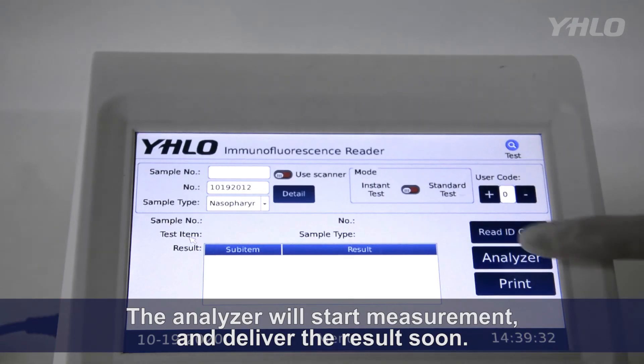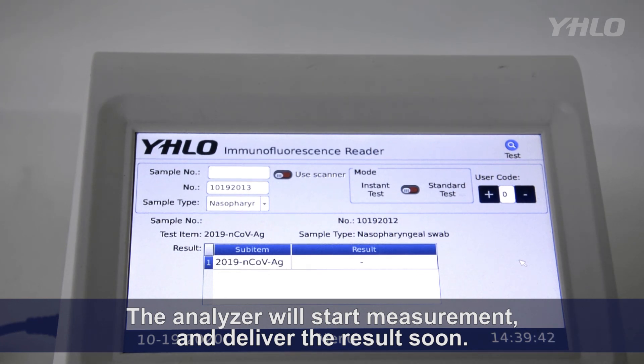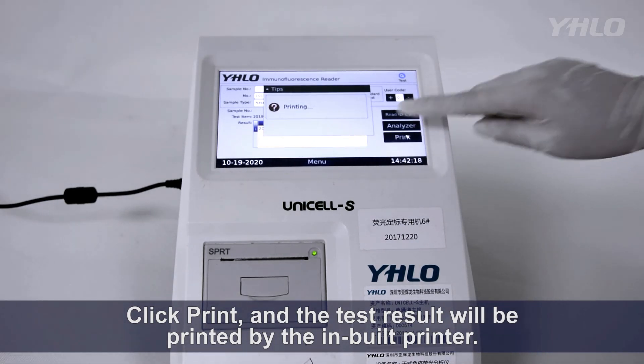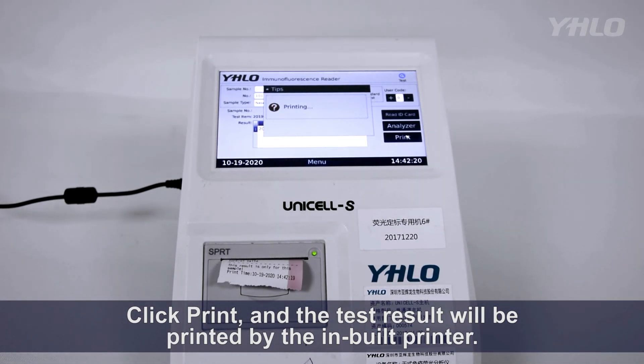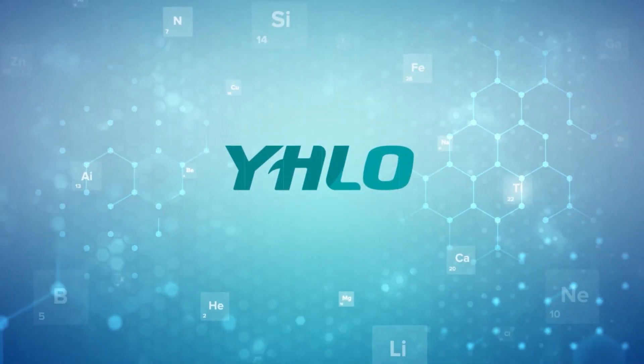The analyzer will start measurement and deliver the result soon. Click Print, and the test result will be printed by the inbuilt printer.